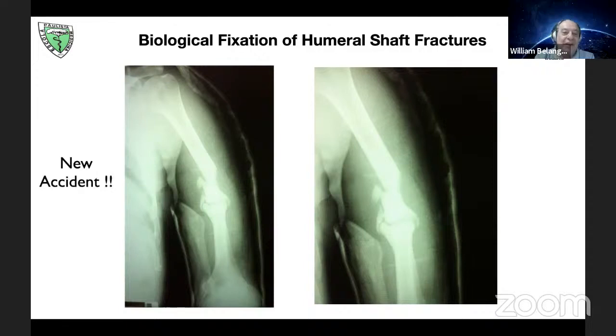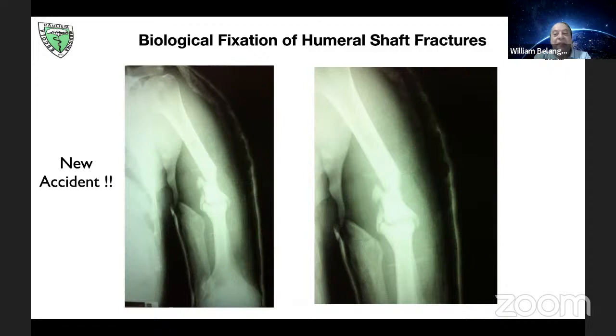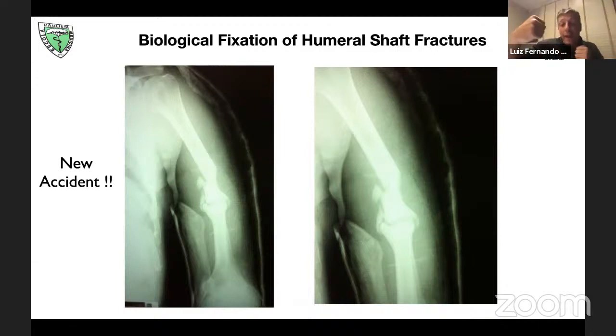Coco, this is a very good indication for a bridge plate, an anterior bridge plate. You can treat both conditions. All right. Treat the fracture, and then you treat the delayed union. Dr. Sergio wants to put the patient face down, open the posterior aspect of the humerus. You want to shorten the humerus and make a plate with thousands of screws.